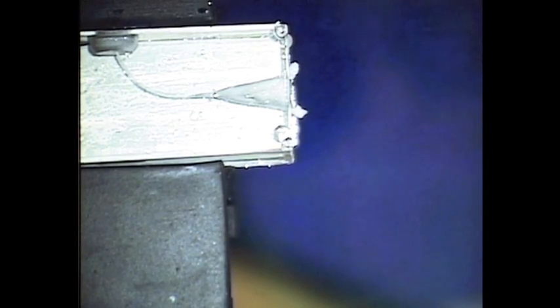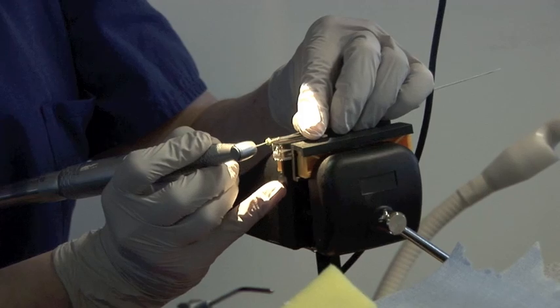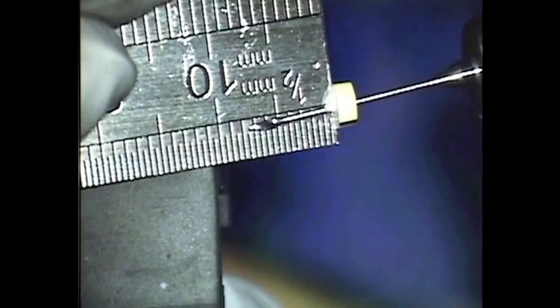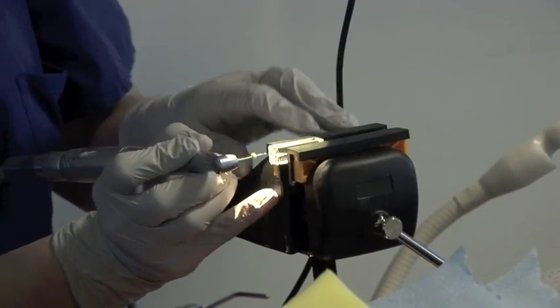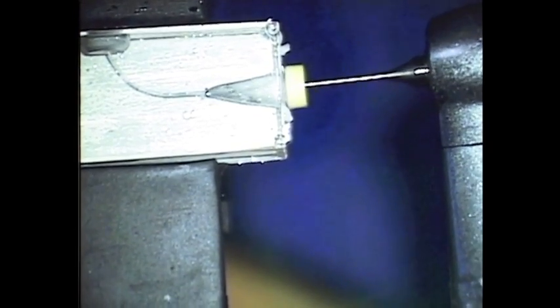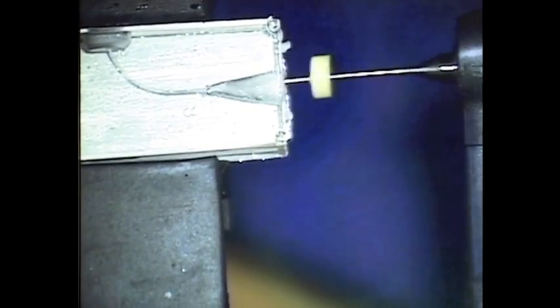As you can see it hasn't gone down to where I measured it to, but we need to check and also get rid of some of the debris which you can place in your sponge. We'll just measure again to see where it is — you can see very slightly that the stopper has moved, so I'm just going to readjust it to 7.5. Light brush strokes on the way out circumferentially, and always keep away from the dangerous zone in the furcation area. Only ever use it in the safe zone.